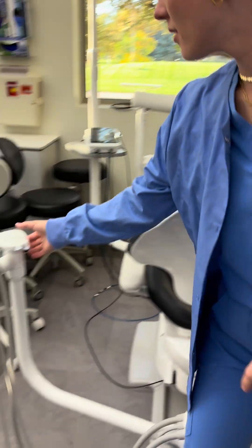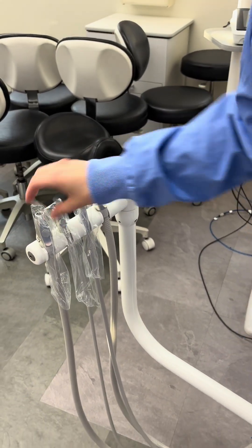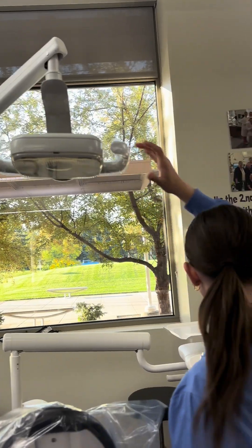She's checking that each barrier is secure and will not come up. Make sure every barrier is good.